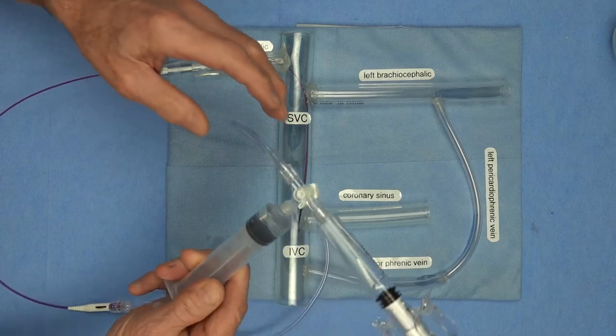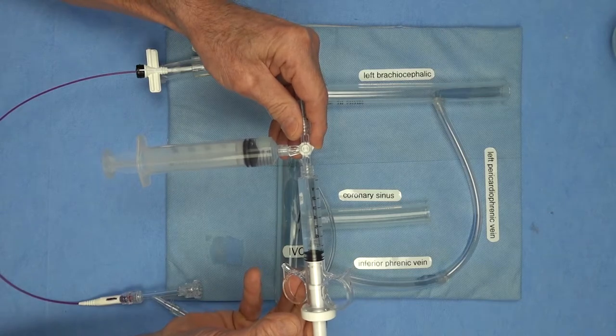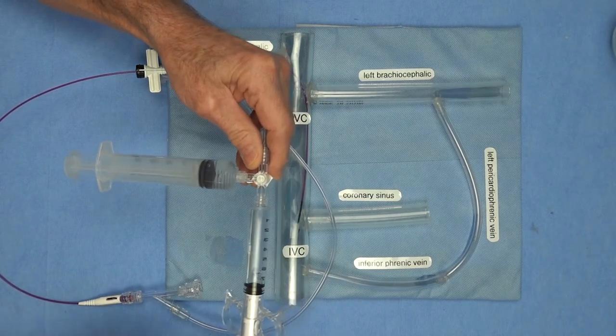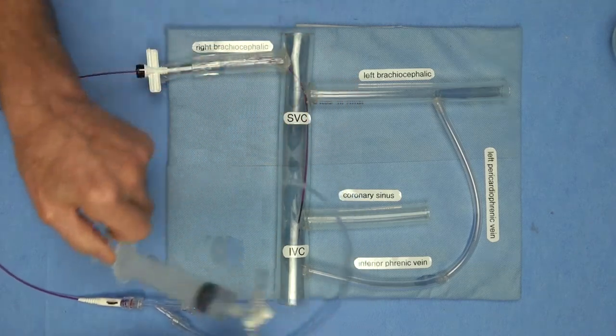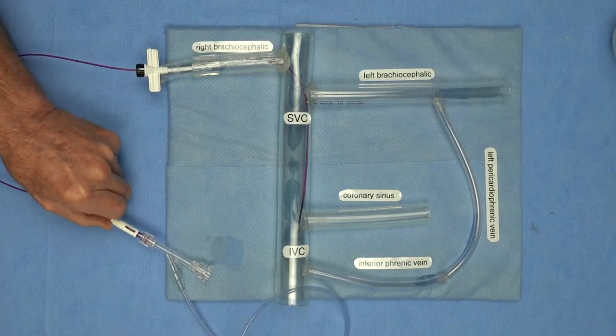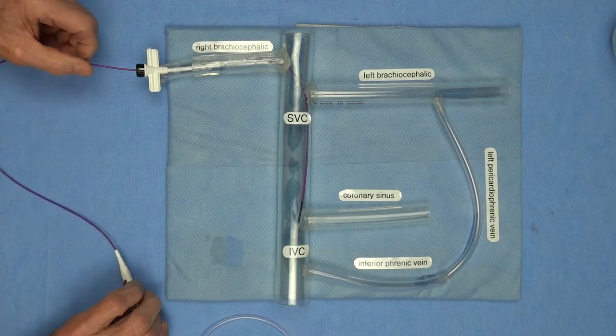And again, be smart. Use an injection system. Don't attach the wire, don't attach the syringe to the end of the catheter. That's just making it work extra hard.